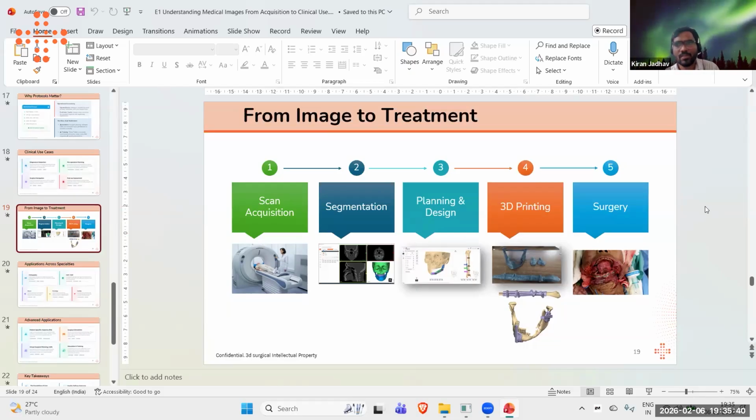So there is an opportunity for software engineers here as well to create an automatic segmentation model. It can focus on the OMF or other parts of the body. So this is also an opportunity.